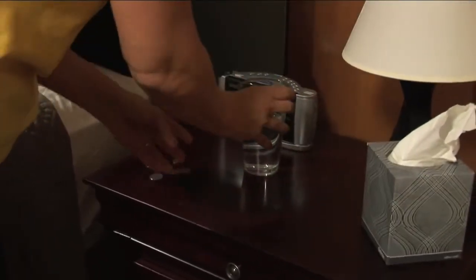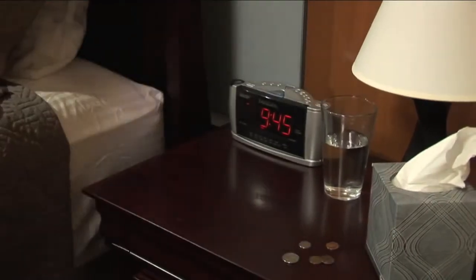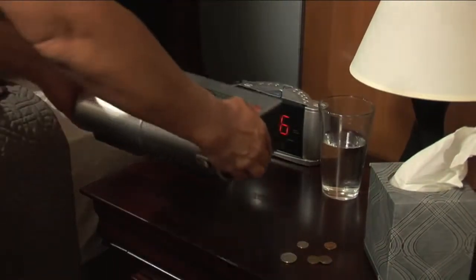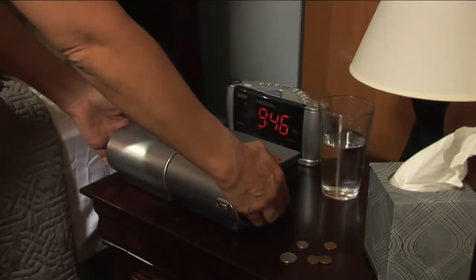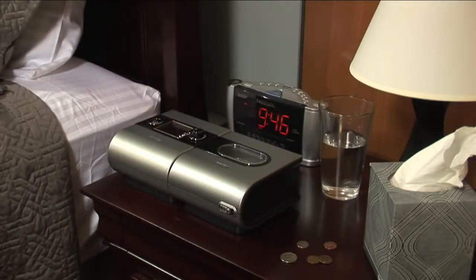When placing your CPAP system in your bedroom, you want to make sure the area around the device is clear. The device draws in air, and if this air intake is blocked, the device may not operate correctly. For the same reason, we recommend you don't put the device on the floor.